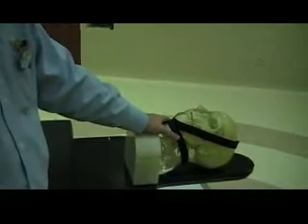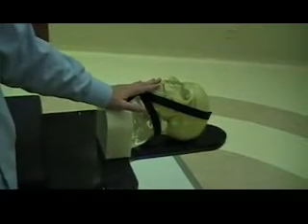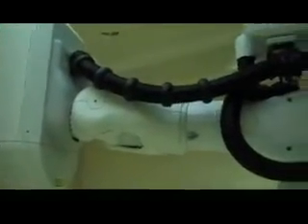And the second thing that'll happen is, even when we're not completely on with the patient with the couch moved, even if the patient is not completely on, the robot will adjust for the fiducials being where they are. So even with the couch movement, putting the patient in spot, if it says we need to move over 2 millimeters, the robot will move over the 2 millimeters.